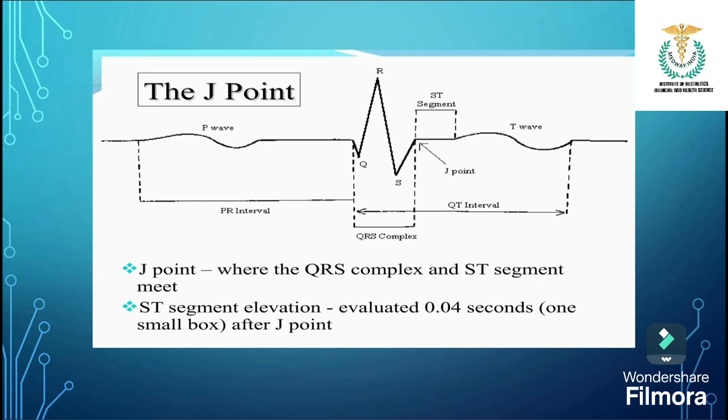So 0.04 seconds means one small box after the J point. You can see this is the J point. After this J point, the ST segment is elevated.